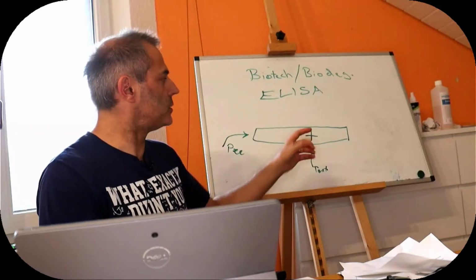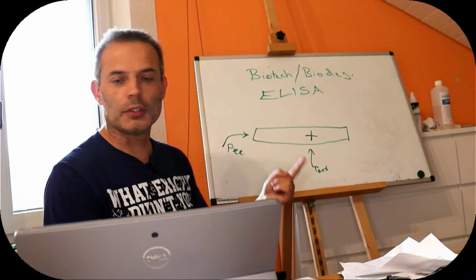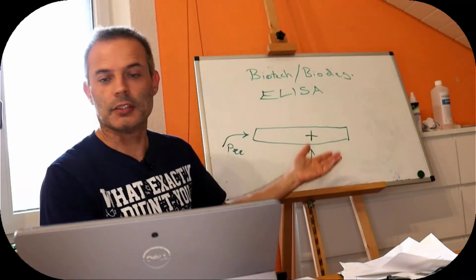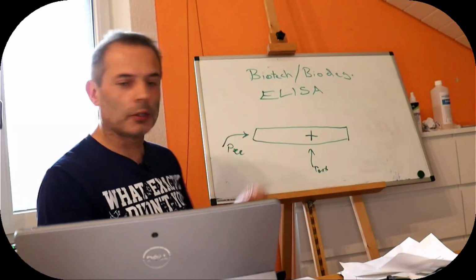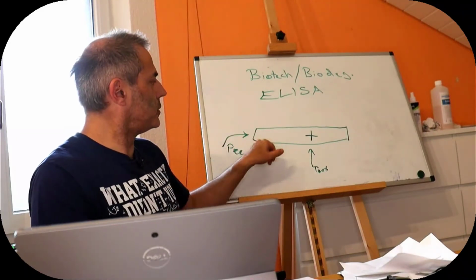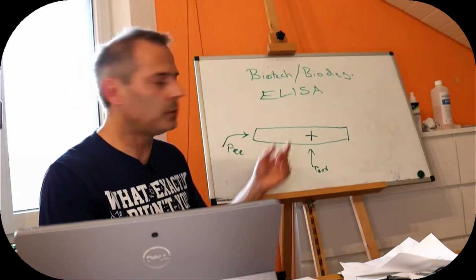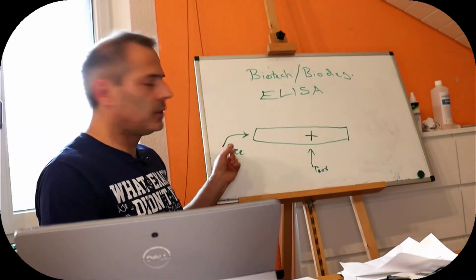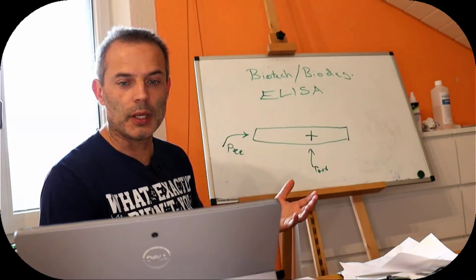But the basic system has two bits of information at this end, one or two lines, one of them to tell us that the machine is working, and the other one to tell us that it has done the thing that we want to measure. So what is it doing? It's measuring a protein in wee, human gonadotrophin protein, and it's going to determine whether it passes a threshold amount or not. That's all it can do, because we've only got a plus-minus test. And we need to do that using some way, so we need to detect the molecule in the pee.